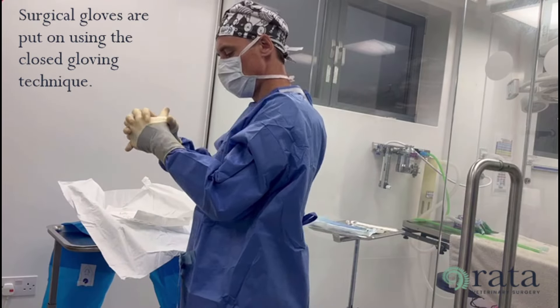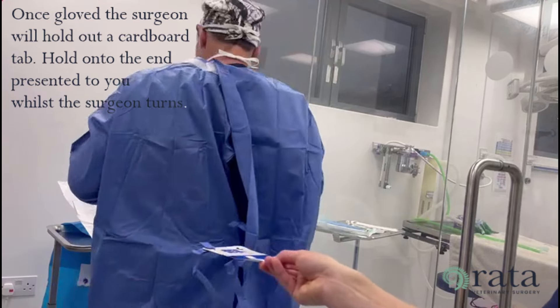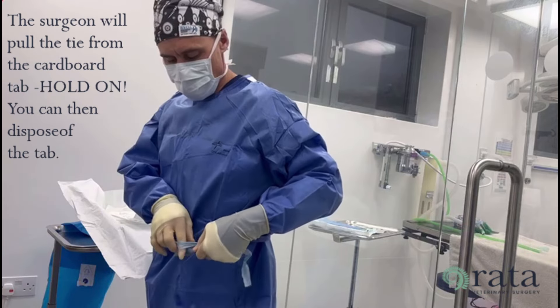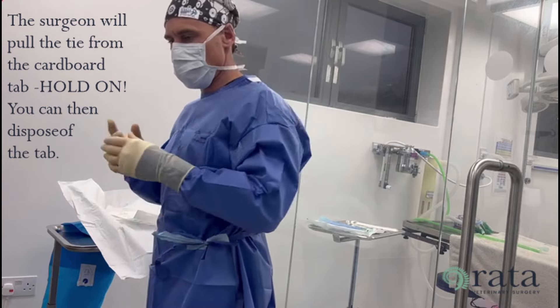The surgical gloves are put on using the closed gloving technique. Once gloved, the surgeon will hold out a cardboard tab. Hold on to the end presented to you whilst the surgeon turns. The surgeon will pull the tie from the cardboard tab — ensure you keep hold of it. You can then dispose of the tab.